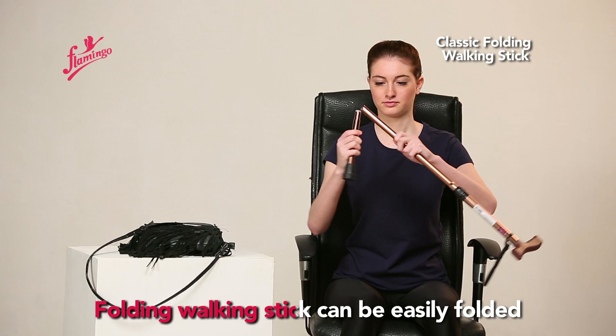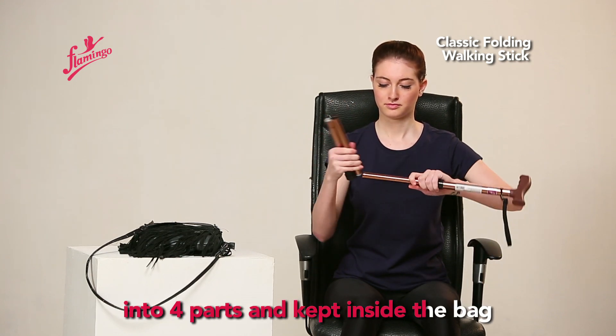The folding walking stick can be easily folded into 4 parts and kept inside a bag.